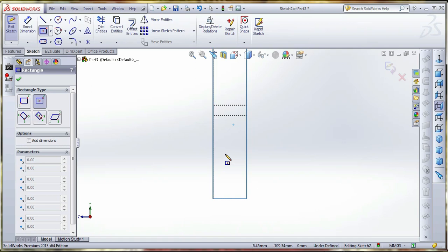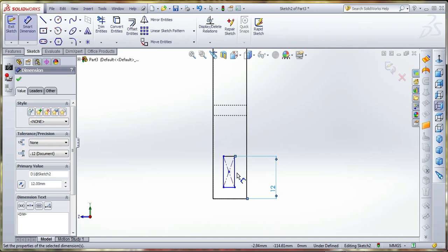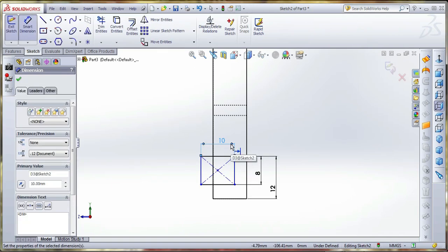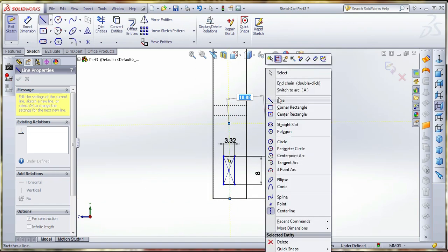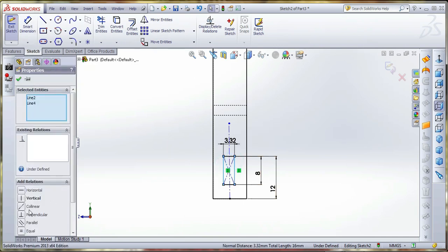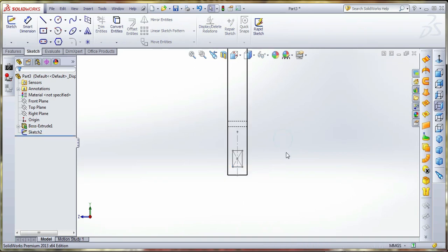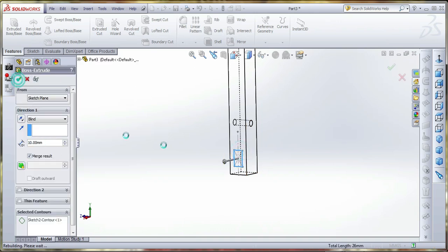Here to make a small pin. The supporting pin is located here. Okay, make it symmetric. This is 5. So extrude. The thickness is 10.